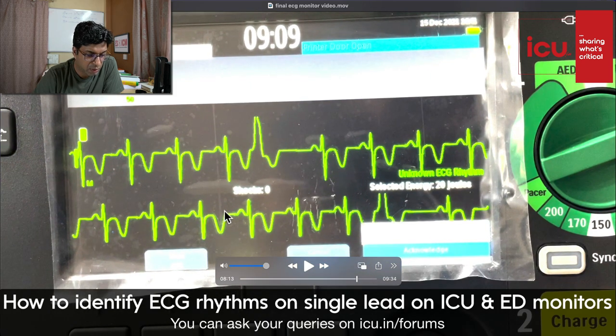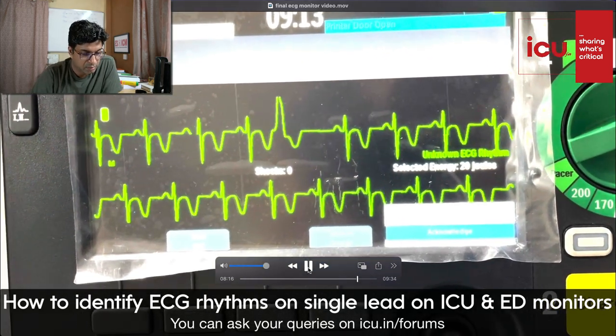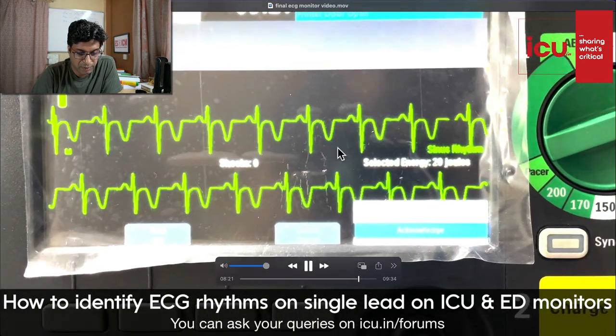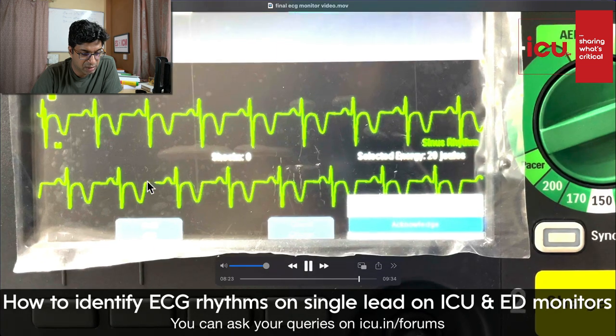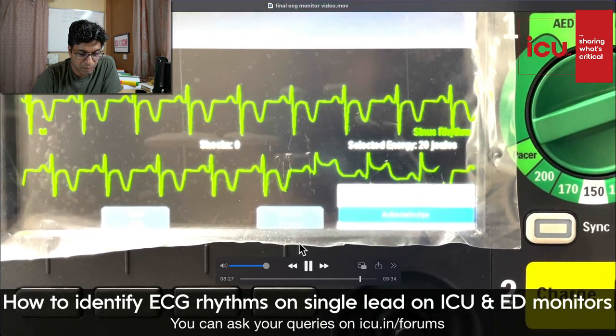Okay, here you can see the T wave inversions. If you see new T wave inversions in your ECG, it's a sign of ischemia. You need to pick up. Many times we see many resident staff pick up ischemia on the monitor itself. So T wave inversions are there. Sinus rhythm because it's originating from the sinus node, but T wave inversions are there.